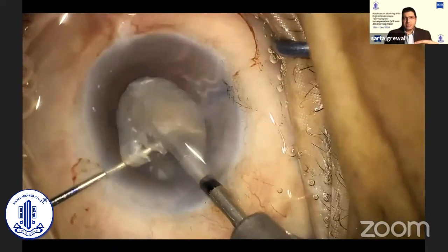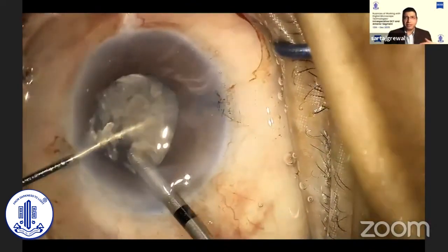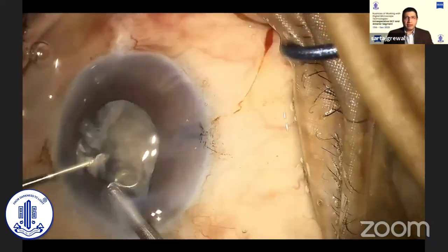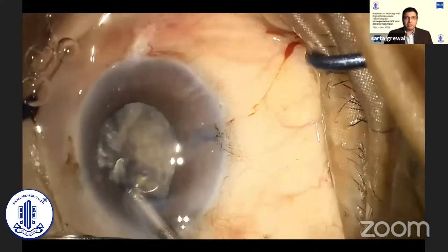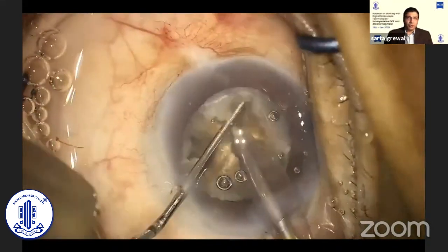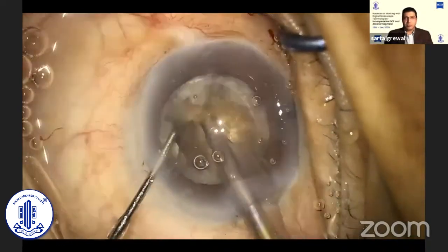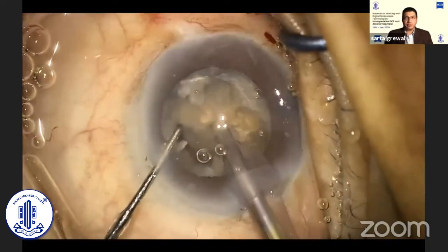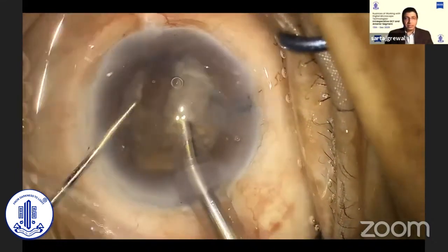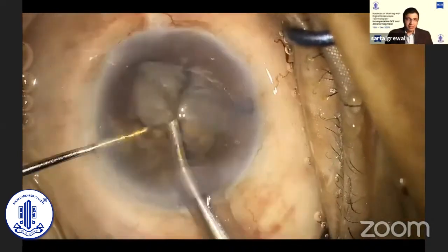In certain challenging situations where you might not be able to divide the nucleus evenly in the first go, you can easily proceed and first emulsify the smaller fragment. Then you can use the MyLoop, go back in, and further divide the larger fragment into smaller pieces and then proceed with phacoemulsifying them. The MyLoop can be easily redeployed to divide the nucleus at any stage of the surgery, irrespective of whether the nucleus is even in the anterior chamber.